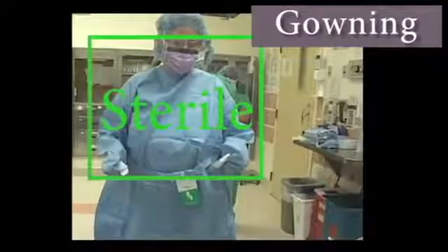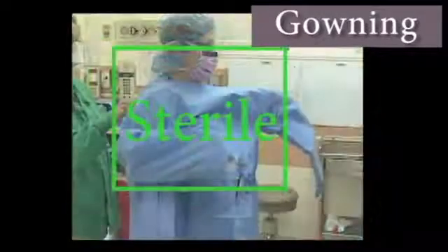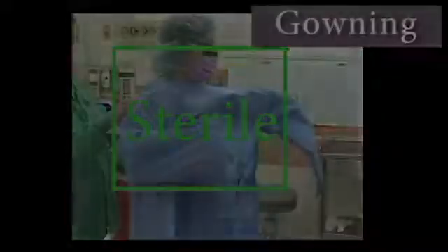Once the gown is on, keep your arms in front of your body at a level below the axilla and above the waist. This is the only area other than the lower arms that is considered sterile.